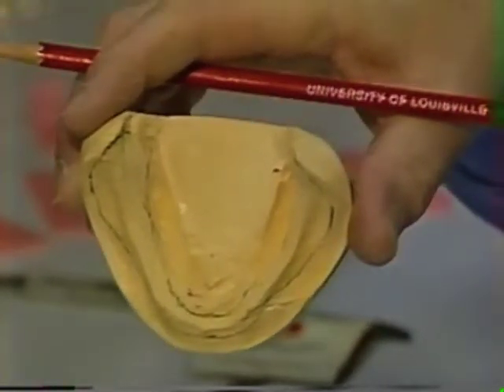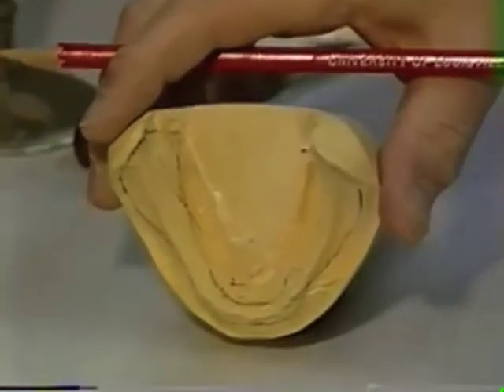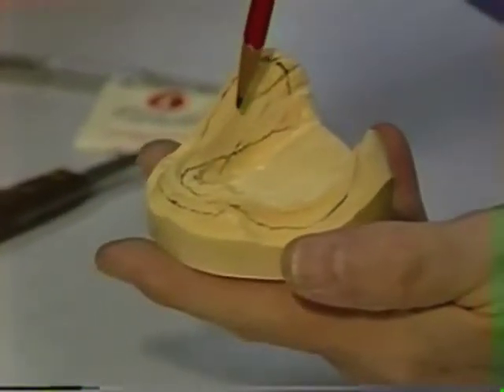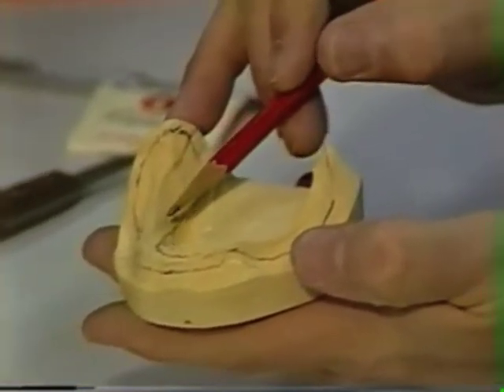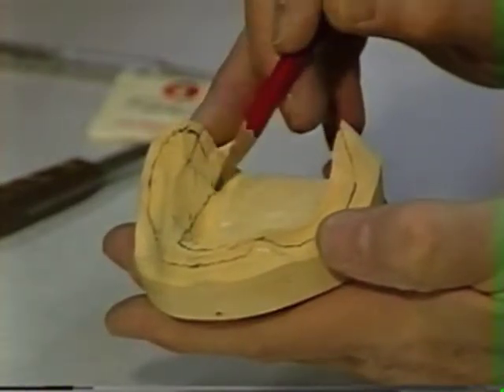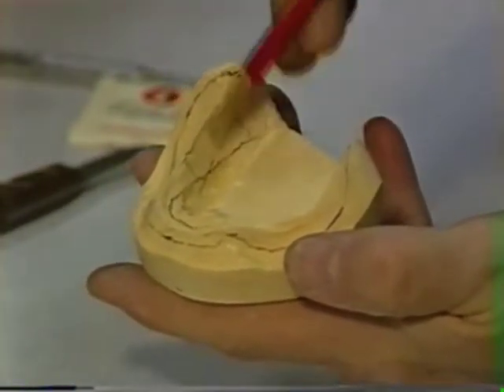The next thing that we want to worry about in forming relief wax for the mandibular arch is the area of the mylohyoid muscle and the mylohyoid line. In other words, this area right here where we're going to have the tray extending beyond the mylohyoid line. In those areas, what I generally like to do is to over-relieve the cast by placing an extra 1 or 2 thicknesses of base plate wax from the crest of the ridge lingually in this area to over-relieve the cast.